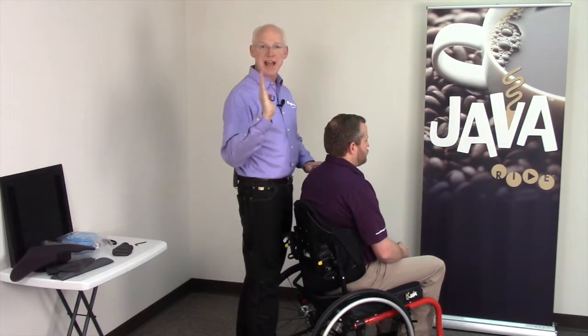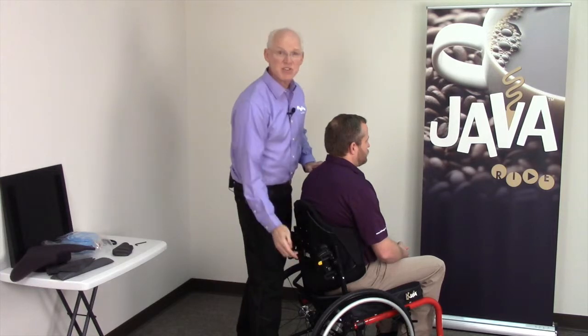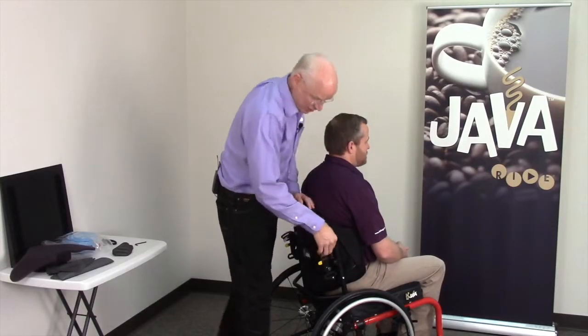The next thing I'm going to do is adjust his back angle. When I adjust his back angle, the pivot is staying right where it was, right at the PSIS. So I can go through the full range of back angle on the Java back, when it's adjusted correctly, without affecting pelvic orientation. So I'm going to now go to my back angle adjustment.